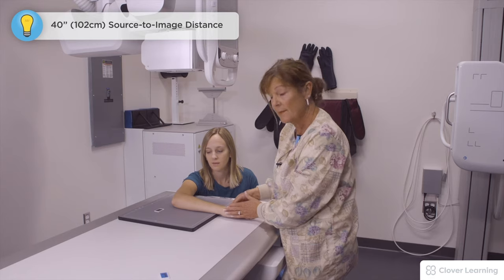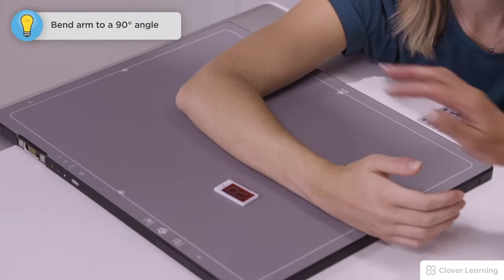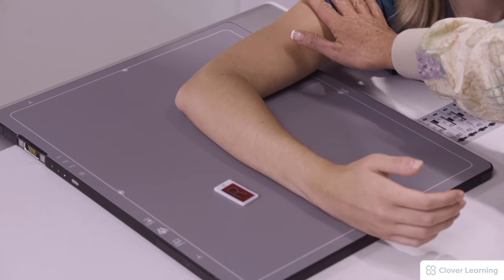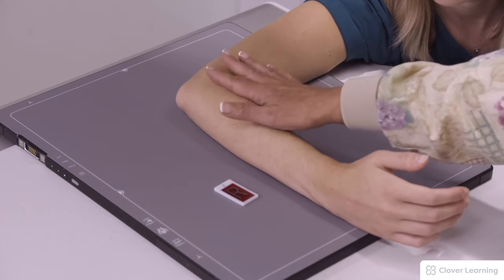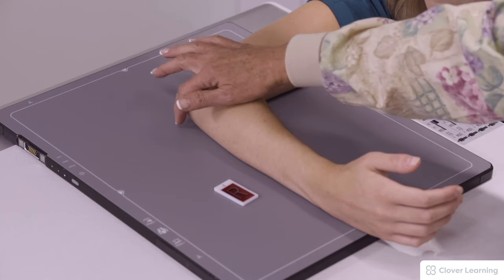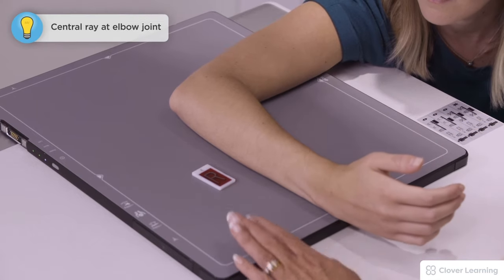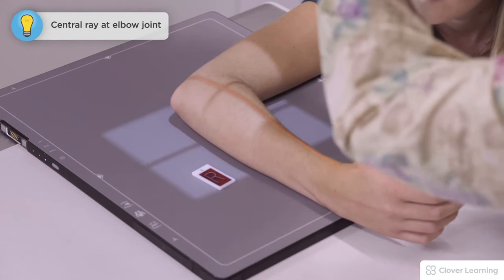So our patient is now 90 degrees. Our palm is exposed like this, and we are going to turn the IR. It is essential that her arm is down, touching the tabletop, so her arm or elbow is in truly a lateral position. So the olecranon is in profile here. We're still centering on top of the elbow joint.